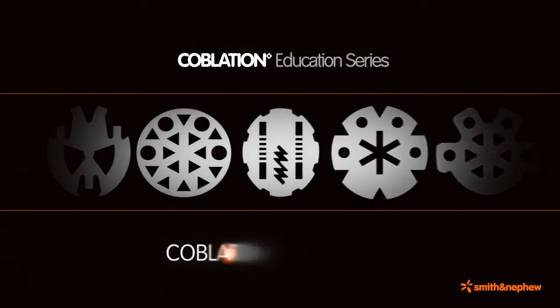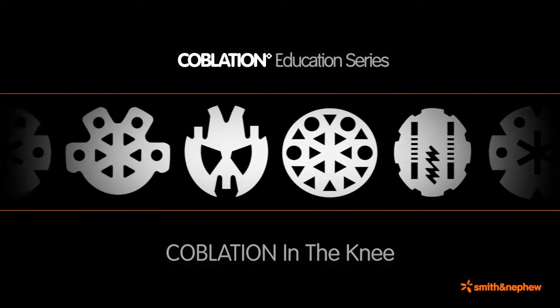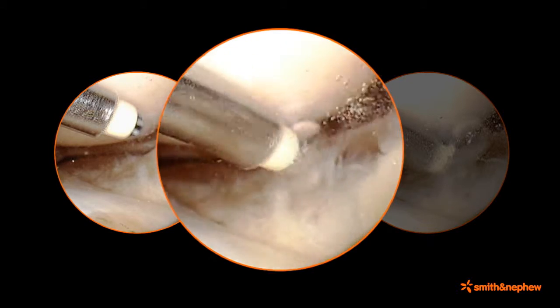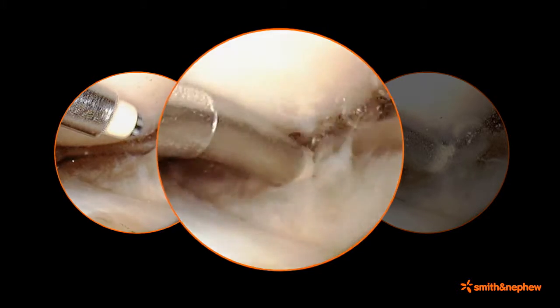Smith and Nephew's Coblation System offers a variety of wands that can be used in knee arthroscopy for chondroplasty, meniscal sculpting, ACL, and other procedures. When Coblation wands are used properly in plasma mode, the plasma can be used to ablate and resect cartilage and meniscal tissue with minimal impact to surrounding tissue.